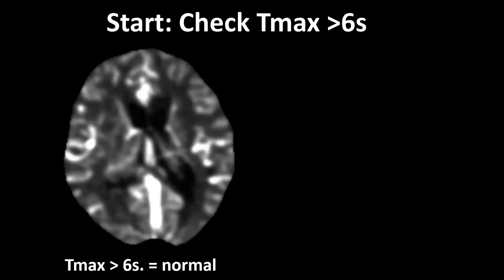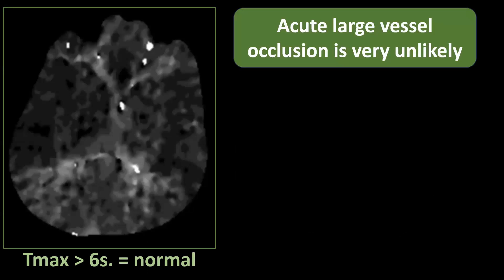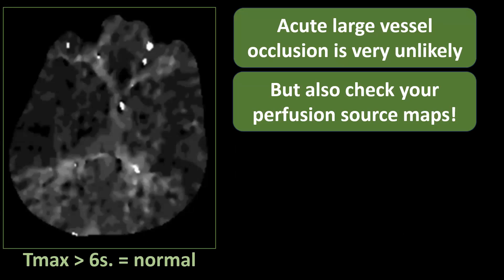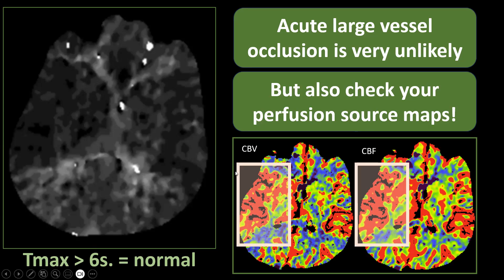The Tmax >6 seconds map can be either completely normal — which is reassuring — or abnormal. With a normal Tmax map, an acute large vessel occlusion is very unlikely. Nevertheless, we should examine CT angiography and non-contrast enhanced CT, and definitely check our other perfusion source maps, because these can sometimes provide a clue to the diagnosis. For example, a patient can have seizure-related perfusion abnormalities, like hyperperfusion in the right perisylvian region, as visible on the cerebral blood volume and cerebral blood flow maps.